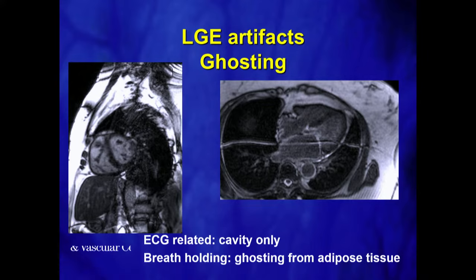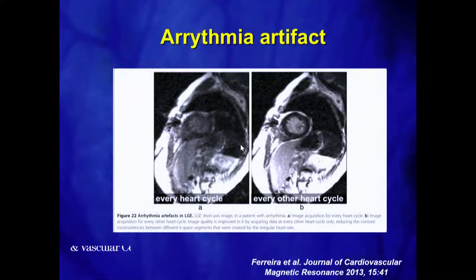But if these ghosting artifacts occur because the patient did take a breath in, then usually you're going to see the ghosting start at the adipose tissue and extend. So you can see here, this starts at the adipose tissue and extends. So this is more likely to be a breathing motion artifact.